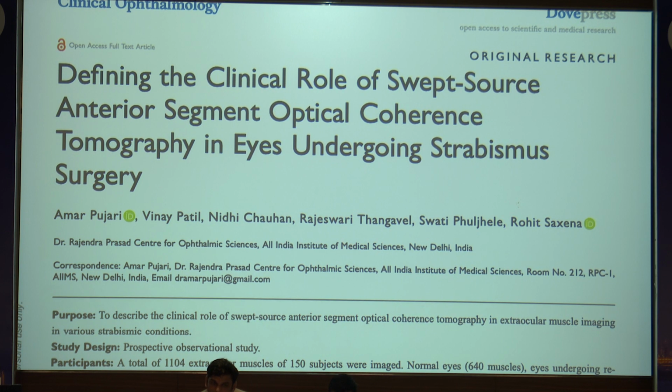So in future, we hope that as we image the MGD and map the Meibomian glands, if you ask the patient to adduct and you screen the lateral sclera, you will be able to see the muscles there. If it's recessed or resected, then you can use a caliper and measure the distance.